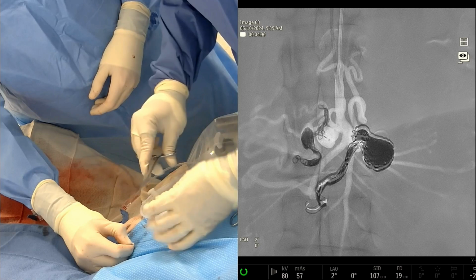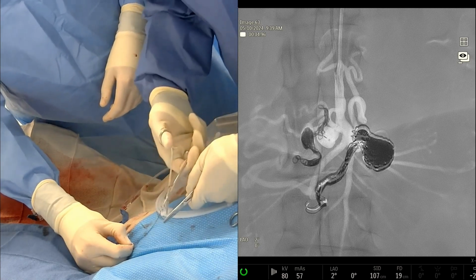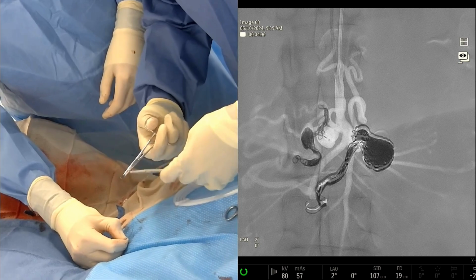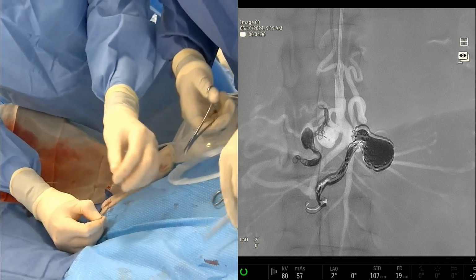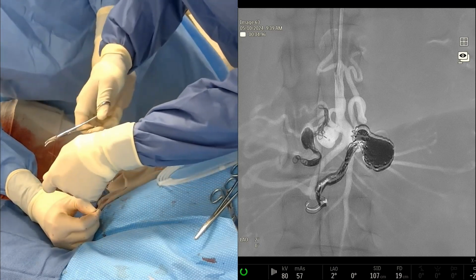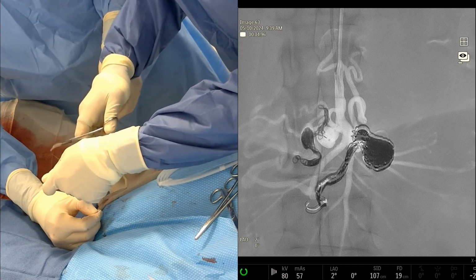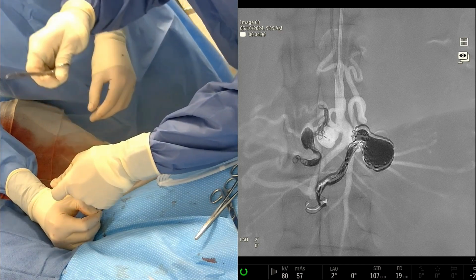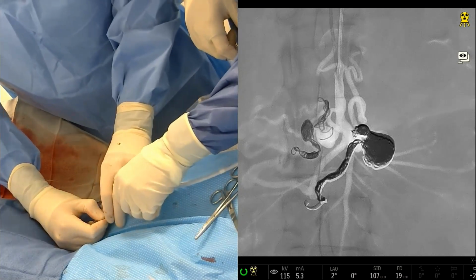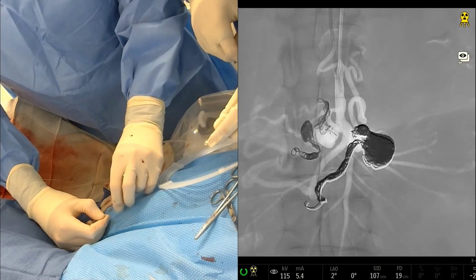You think it's detached already? We tried. You can just pull it, but otherwise you can just pull it out. Yeah, we can just pull it out. I see. Was this the 60 packing? Yep, I think this was the 60 packing, which is basically filling that entire aneurysm there. There we go. Success. You just have to get to the end. You just have to knit the sweater a little bit. Push it. And good. Yeah, now it's off.